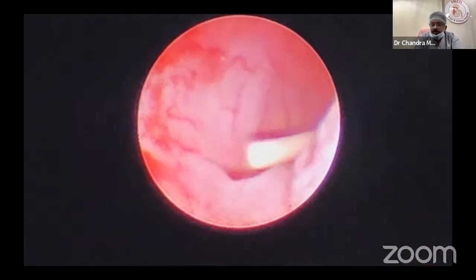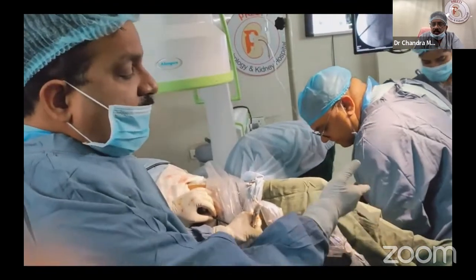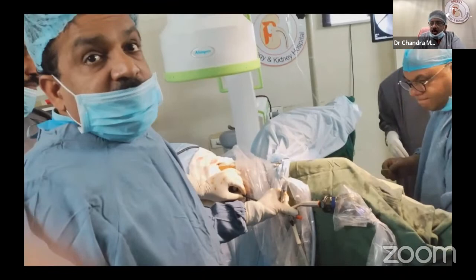Injured. See this picture you take. The obstructing factor is this. This is very important in supine PCNL. If he puts it in normal position, you can easily see. I am observing the upper calyx now. My leg is coming in the way. This is the commonest problem in supine PCNL.